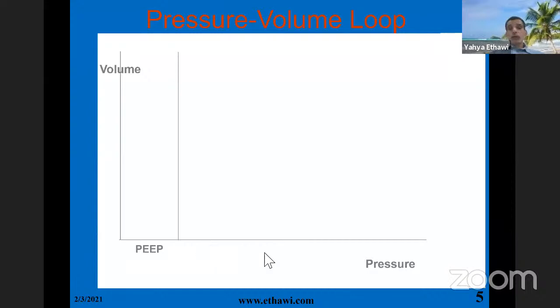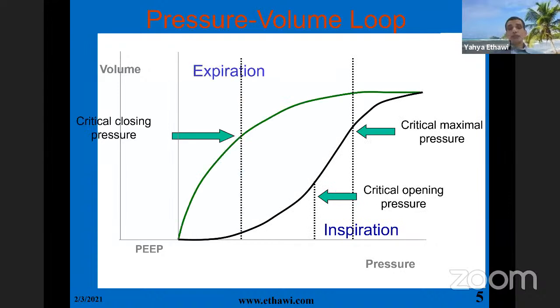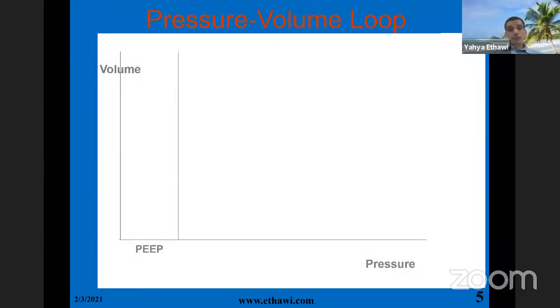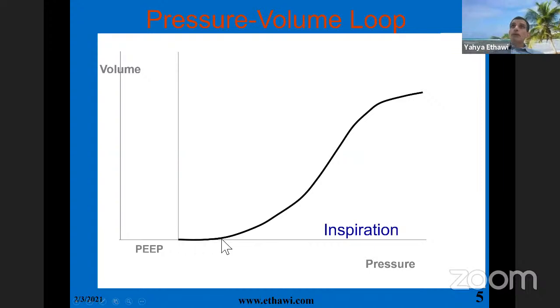So here we have the pressure, and here we have the volume, and this is the PEEP. When we start ventilating, the ventilator gives the inspiration to the patient.